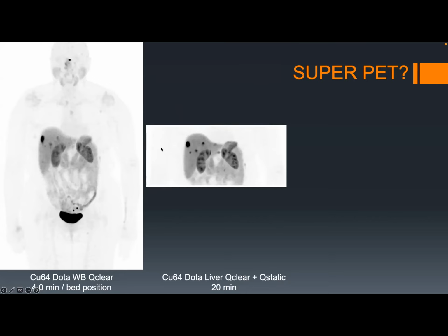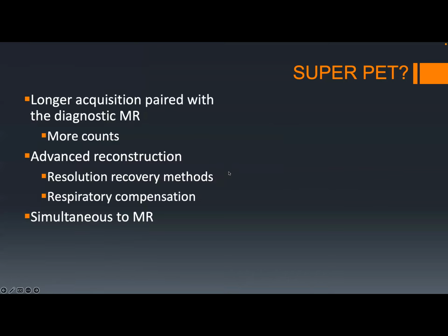You also find things that are missed because of blurring, because of patient habitus, because it's center of the abdomen, it's hard to see. So you notice here, there's a metastasis here. That's actually residual disease of the pancreatic resection margin. This is also something here. These would have been written off as noise had you not had the higher resolution images.